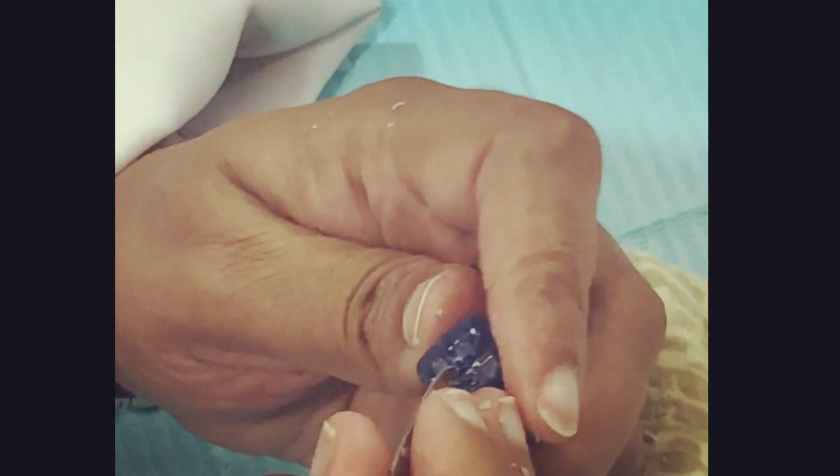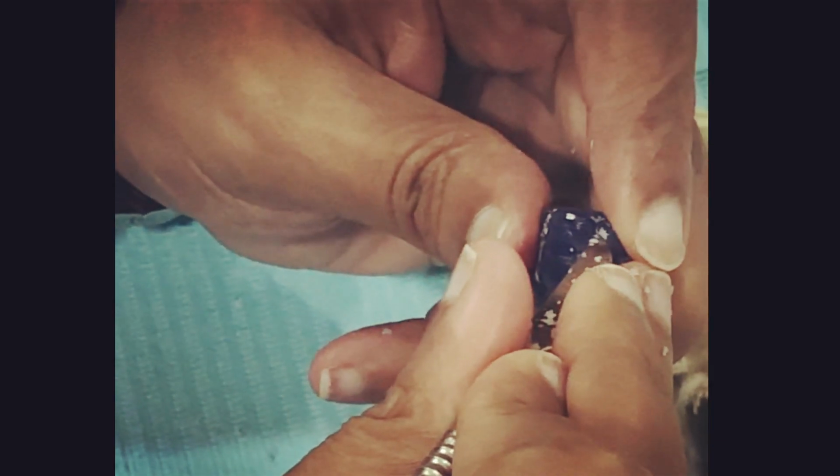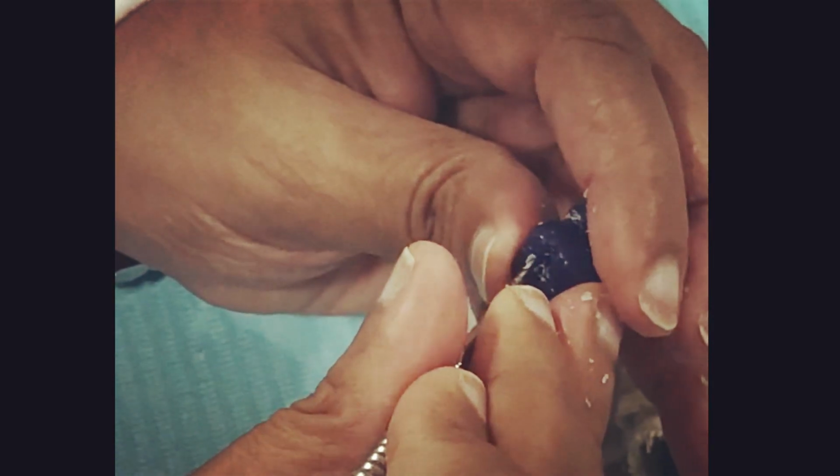That's how you work, and then you do another one like that, and okay, just carve your cusp.